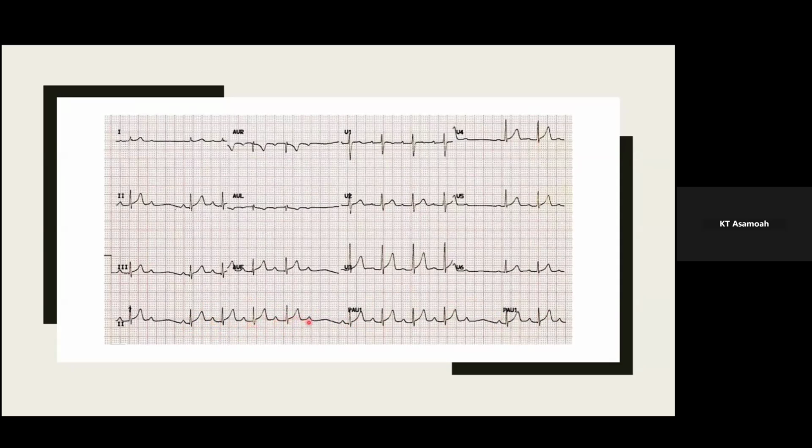And then you have the drop. But the trick with the Wenckebach is that when it's suspected, just look at the PR interval after the drop and the PR interval before the drop. Once the PR interval before the drop is longer than the PR interval after the drop, it invariably confirms that it's a Wenckebach.